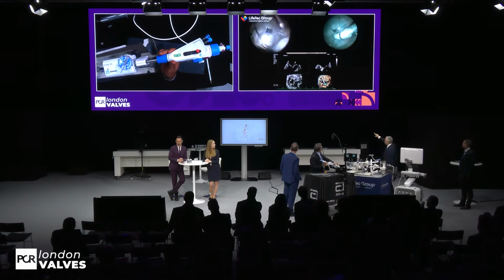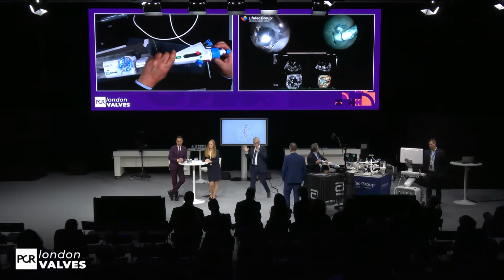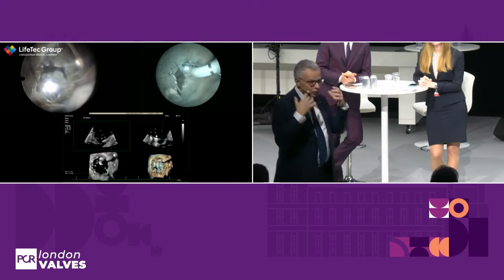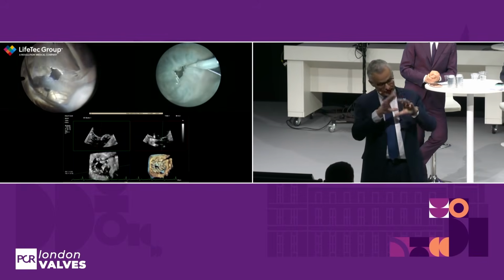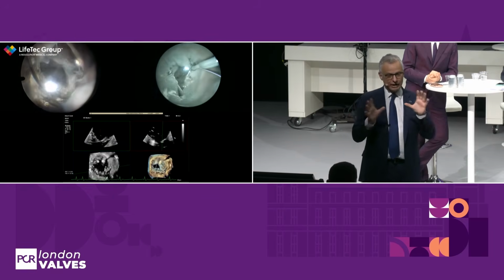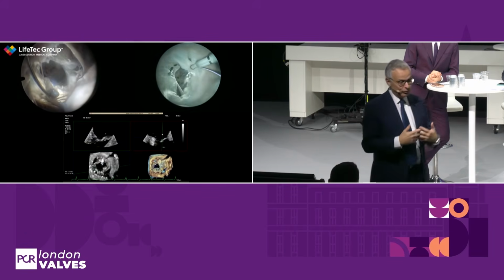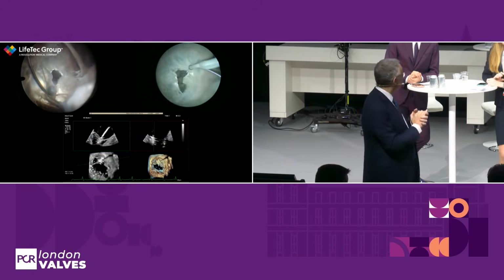Anyhow, the picture you see at the bottom left from the echo is almost a transgastric view, almost, not really the same. In that picture you don't see leaflets, you see chordae. So in transgastric, you can somehow reconstruct the planimetry of the valve. You can imagine where the chordae are, where the commissures are, where the leaflets are, where the chordal-free zones are, where the line of coaptation is. It is the only image that really.